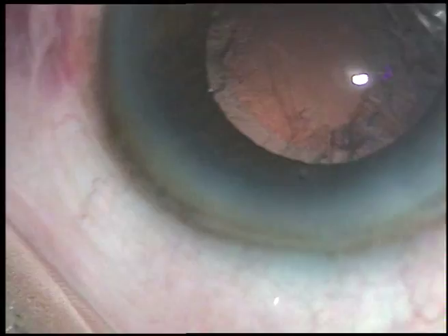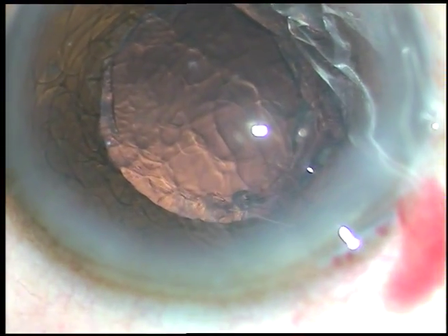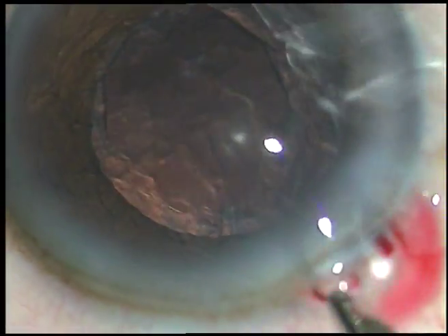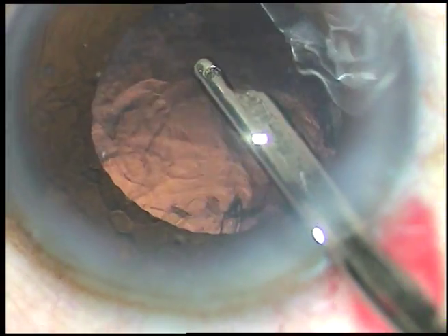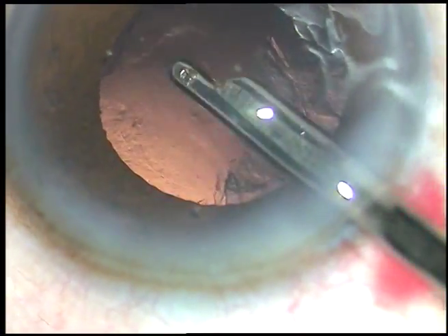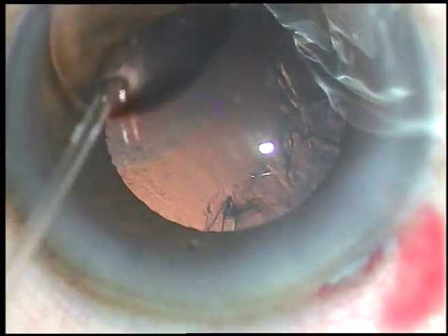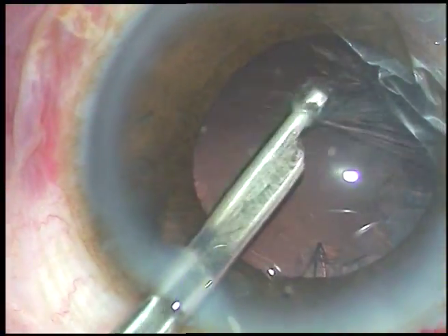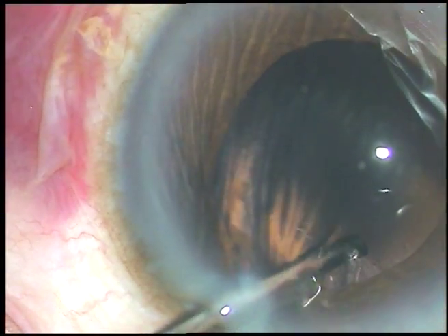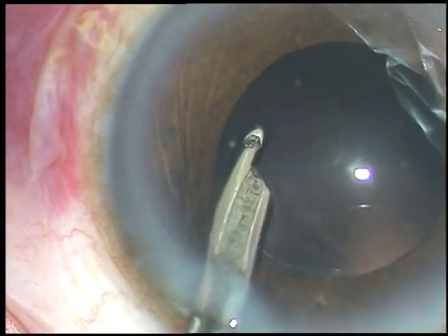A little viscoelastic substance is injected again, and cortical cleanup is being done using this very simple but very efficient instrument — a 23-gauge Simcoe cannula. It works very fast. If you are habituated to bimanual IA, please continue with your favorite instruments.